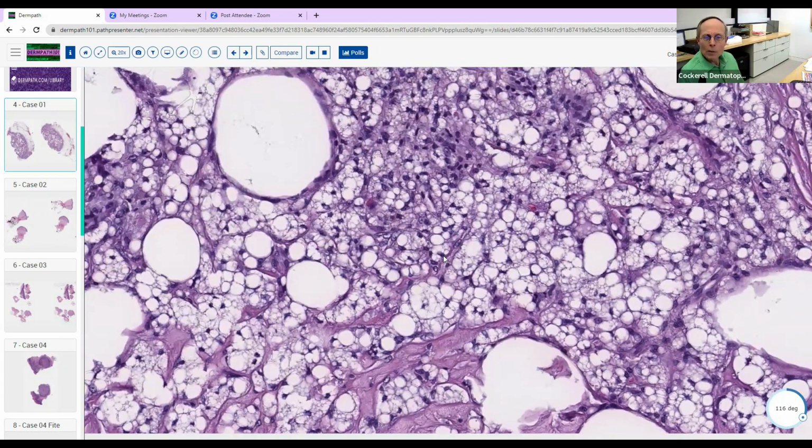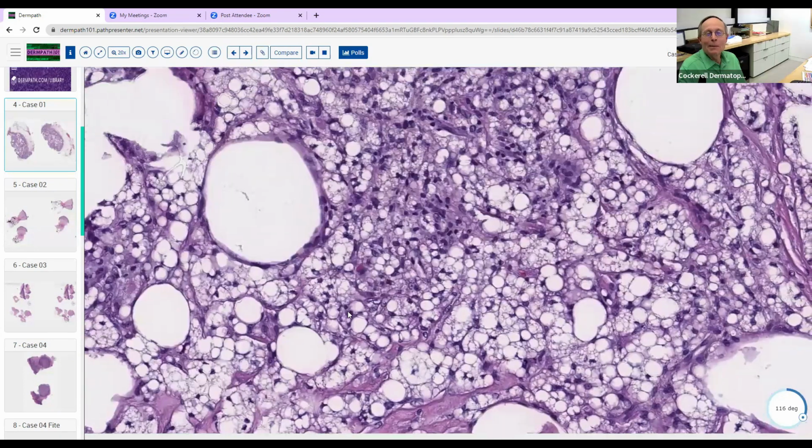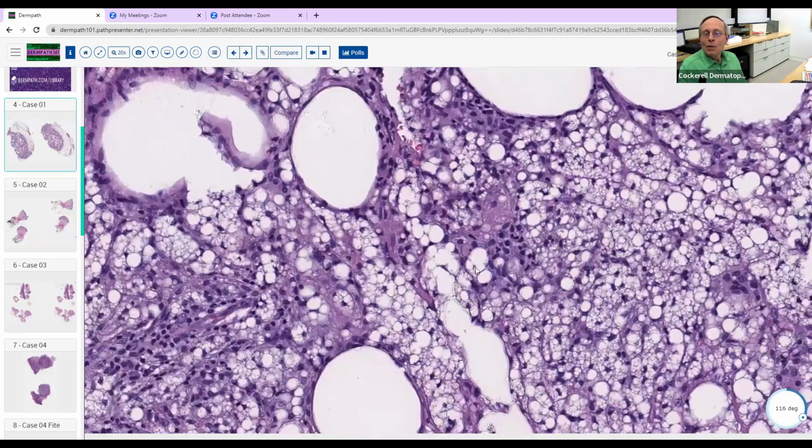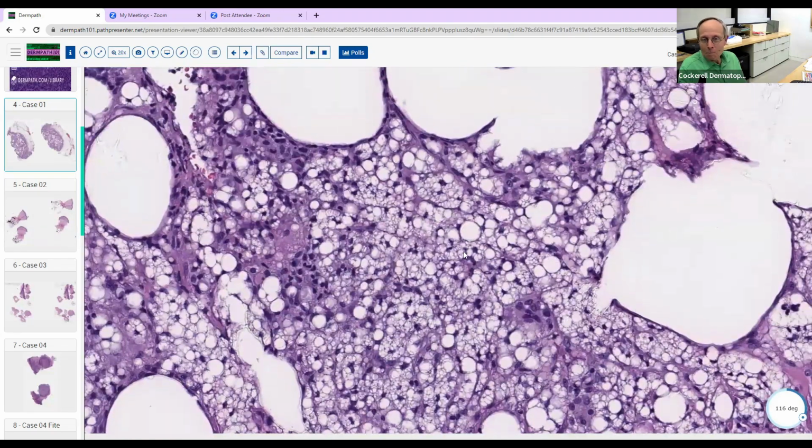So when you think of granulomatous inflammation, certainly infection is one thing that you would think about here. But how long would you think about that, given you've got all this kind of change here? Not very long, probably a second, maybe. Okay. So we've got clear areas here. So the differential diagnosis is clear cells. And one is fat. You're right. Lipid is certainly one of those.